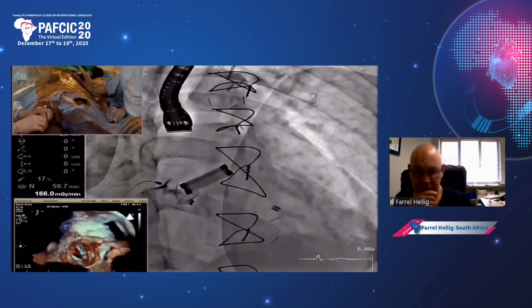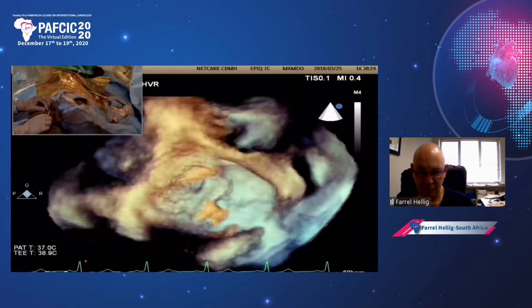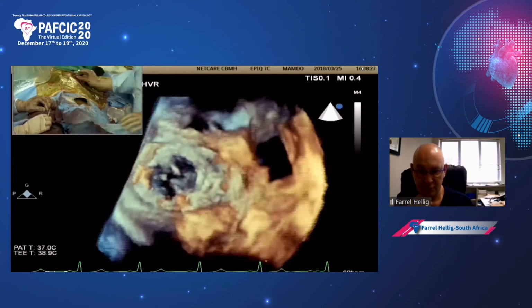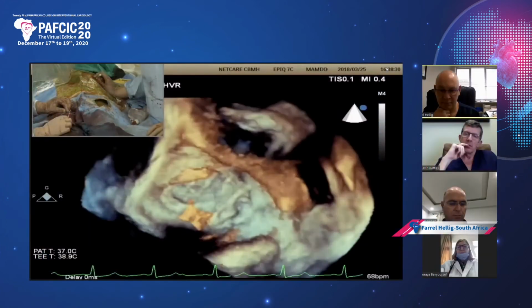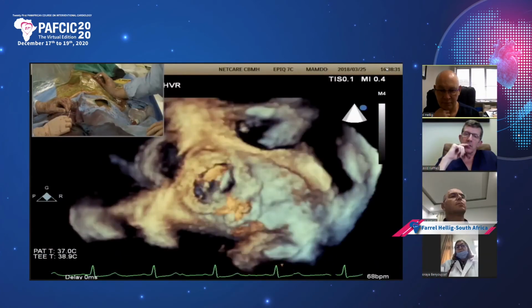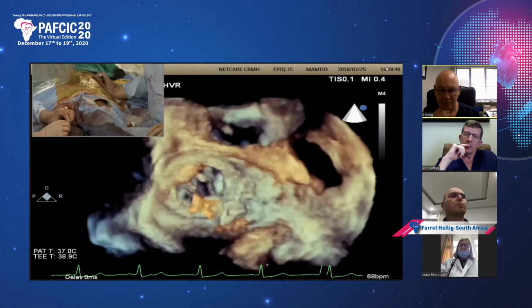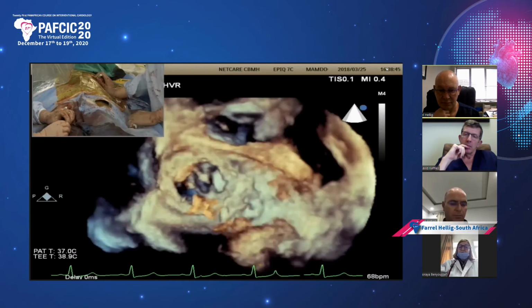The second device is just interdigitated on top of the other one. You can see the threaded inserts are pointing in slightly different directions, which is actually good. If you look at the way the threaded insert is pointing on the second device, it's almost perpendicular to the disc's hinge point, which means we can't be impacting. Can everyone see my screen?